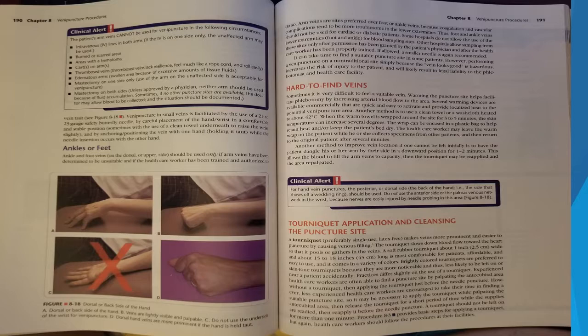Thus, foot and ankle veins should not be used for cardiac or diabetic patients. Some hospitals do not allow the use of lower extremities, foot and ankle, for blood sampling sites. Other hospitals allow sampling from these sites only after permission has been granted by the patient's physician and after the healthcare worker has been properly trained, if allowed. If allowed, a smaller needle is again recommended.